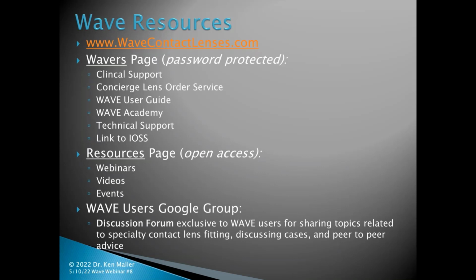Now, the only exception to that is an existing corneal GP lens wearer. You must take into account the size of the lens that they've come in with their presentation. So for example, let's take that 11.7 millimeter cornea, but they came in wearing a 9.2 millimeter lens. You will be in for nothing but heartache if you fit them into an 11.1 or 11.2 lens, starting with the very fact that they can't get the lens off their eye. But additionally to that, their cornea and ocular surface are very, very different from wearing lenses for so many years.